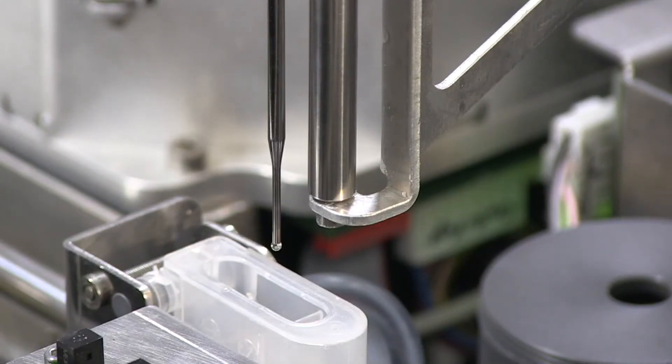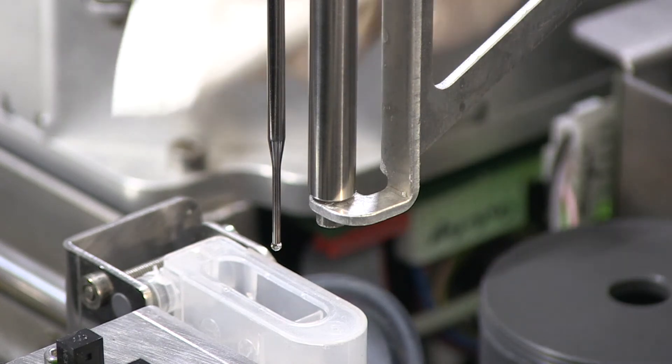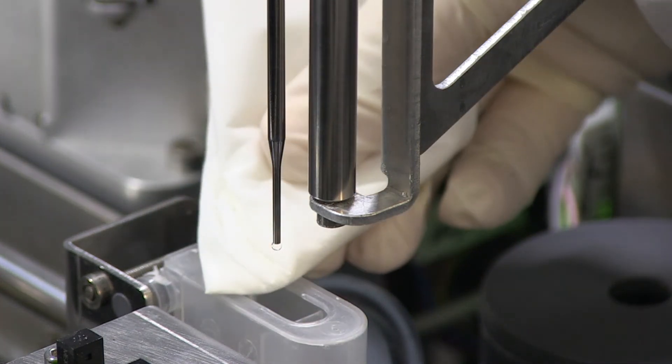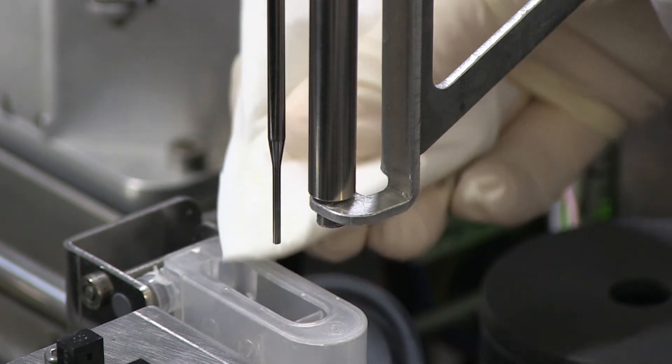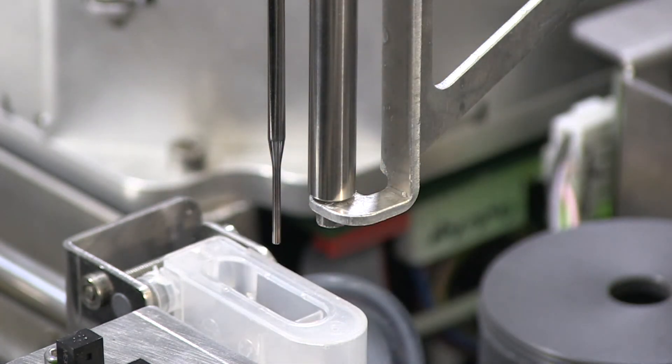Check that there is no drop at the pipettor needle tip after rinsing is completed. Remove any drop by wiping with a lint-free cloth. A liquid droplet will distort the height adjustment of the pipettor needle.